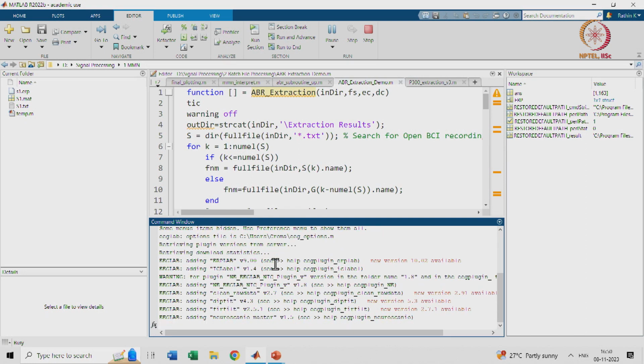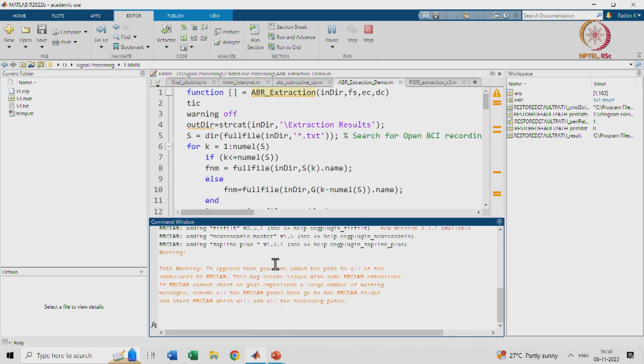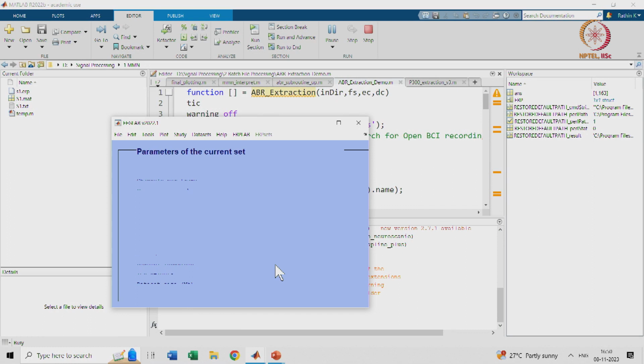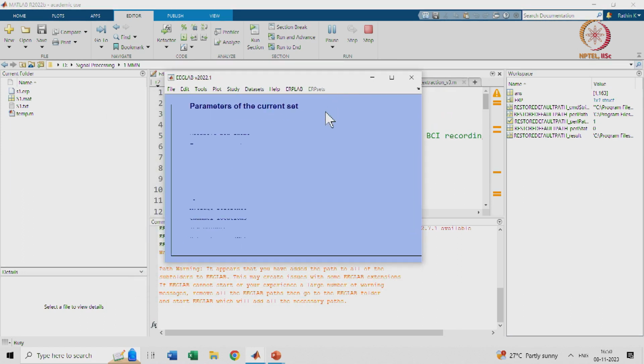Even if the name is EEG Lab, it doesn't mean it cannot do operations for ECG. We have performed ECoG and the signal processing steps of SEEG on that. So it is not limited to EEG, and once you have it installed properly and added to the path, you should be able to see a home screen.